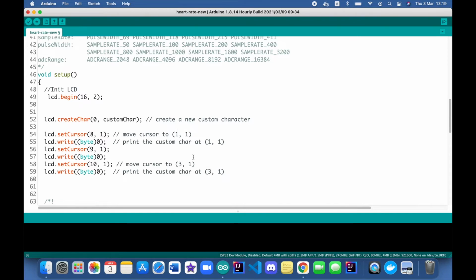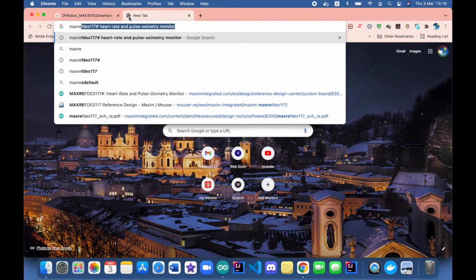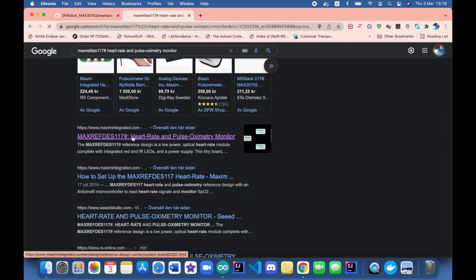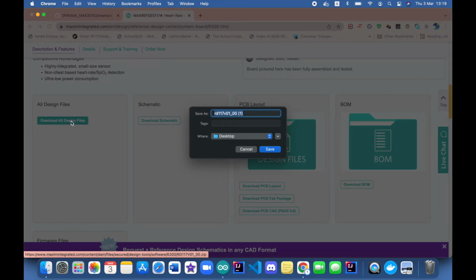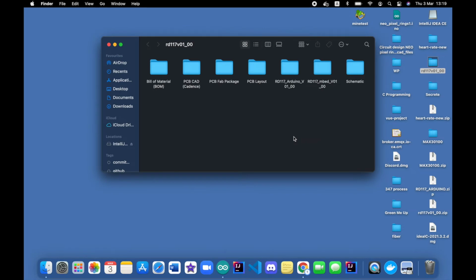One more point about their own original library, which is MAXref. I have googled it so many times now. This one claims that they provide the source code to make it easier to use the sensor. So all the code, everything is here. You can download it. I already have it. It's not actually working. It's really sad to say that, but this original one, I don't know. In some tutorials they show that it works, but not in my case.